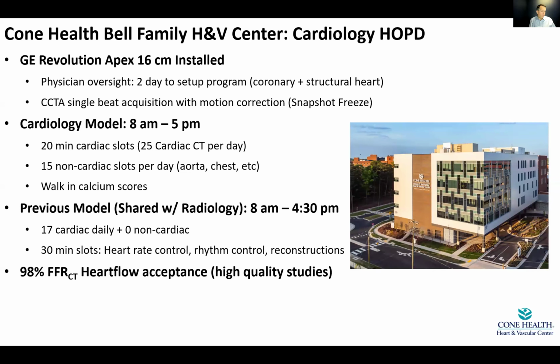Our previous model on a different scanner, narrow beam acquisitions, multi-segment reconstructions. We were doing a full day, but we were only able to do 17 cardiacs a day, and that was it. We were maximized on that scanner. We weren't able to do other non-cardiac structures. As our volume grows, we weren't able to turn up and add on patients who needed cardiac scans.